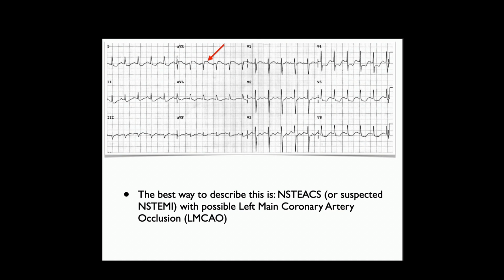For now, if this was a 12 lead on the test, and I'm asking you, what are you seeing? I would like you to answer something like suspected NSTEMI with suspected, and you can abbreviate it if you want, LMCAO, or you can spell it out.